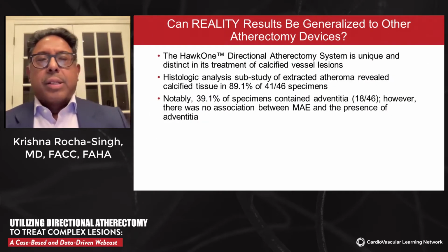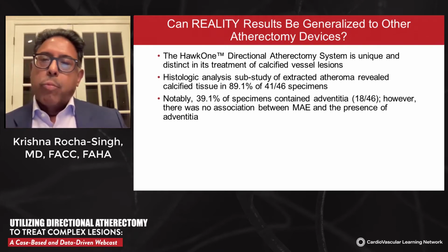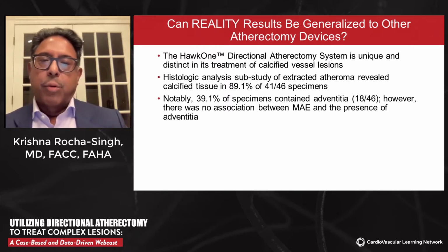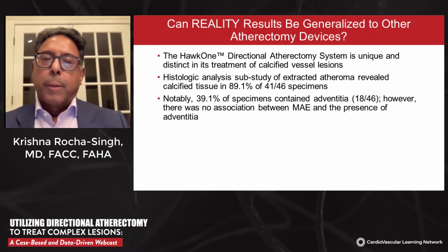Now it has to be discussed the generalizability of the results of REALITY that look specifically at directional atherectomy and a specific DCB platform to other modalities, whether it be other atherectomy devices or potentially fragmentation balloons and other DCB platforms. I think it should be noted that the HawkOne directional atherectomy system is unique in its methodology, its actual cutter. And importantly, and I didn't go into it too deeply here, but it's well defined in our manuscript, that we actually had a histology core lab.